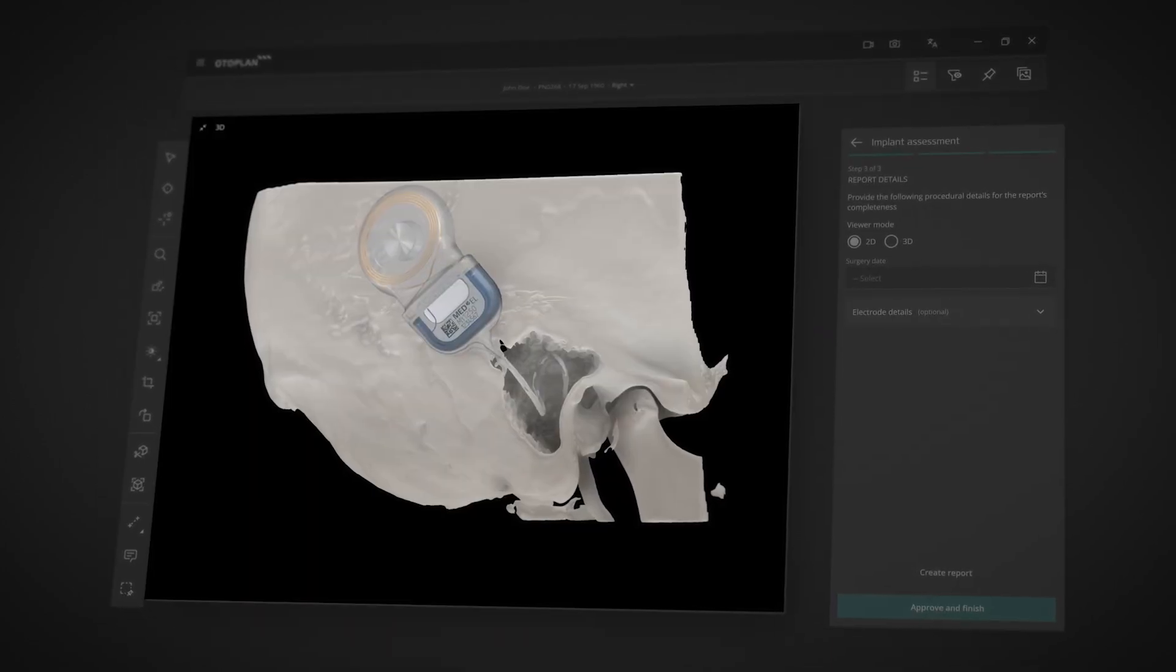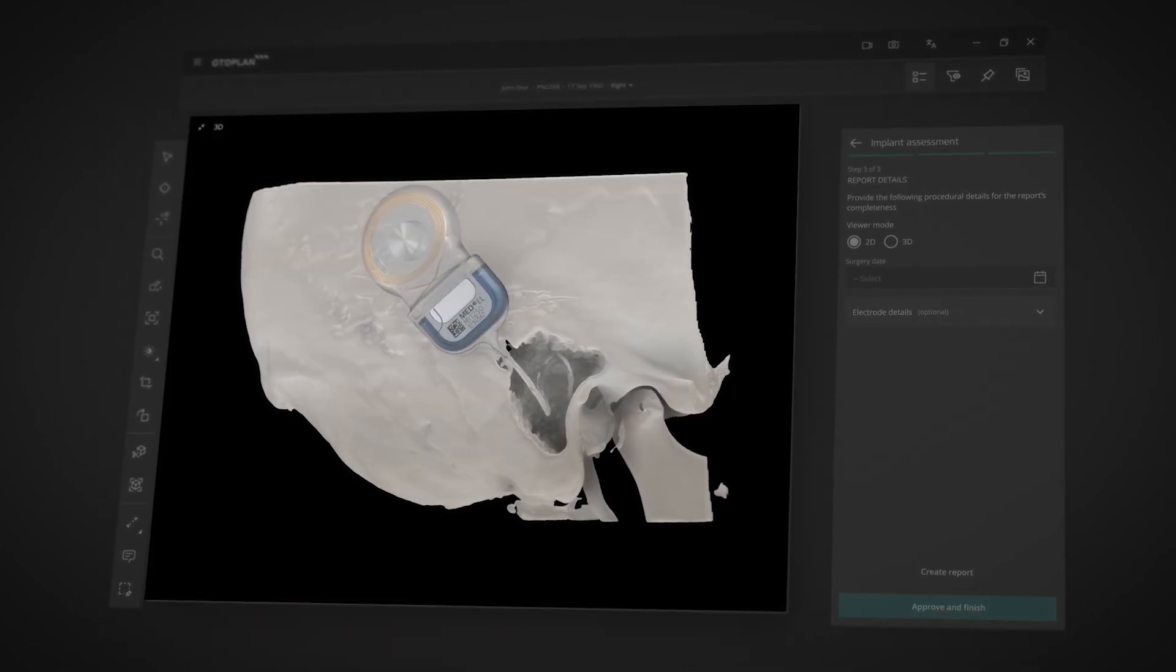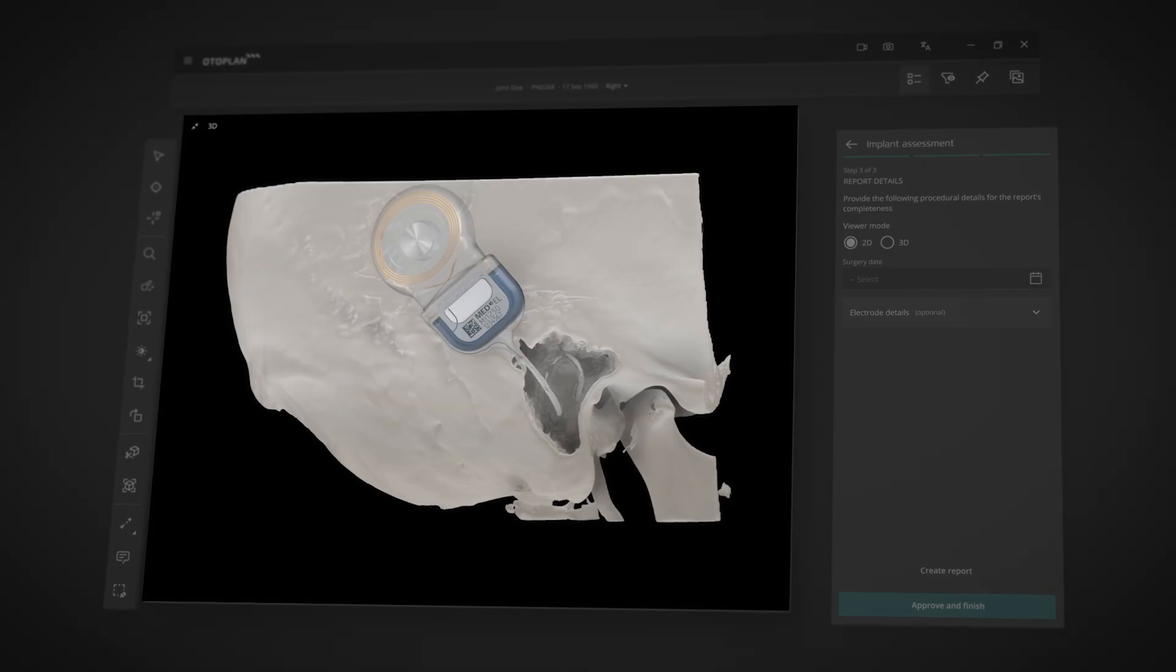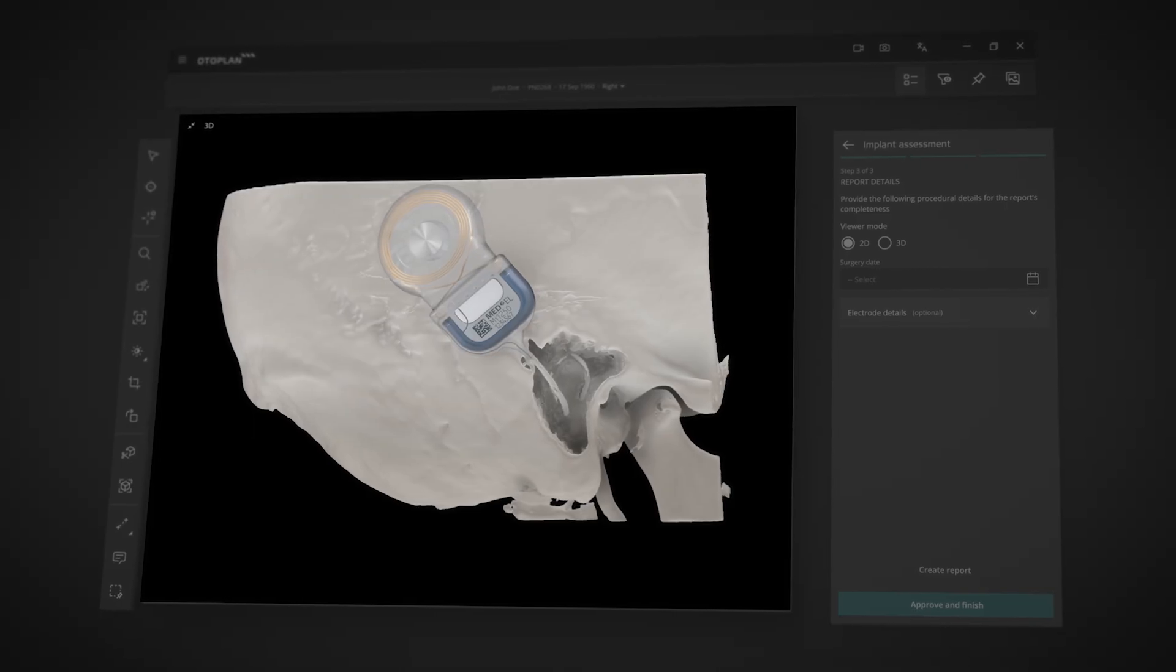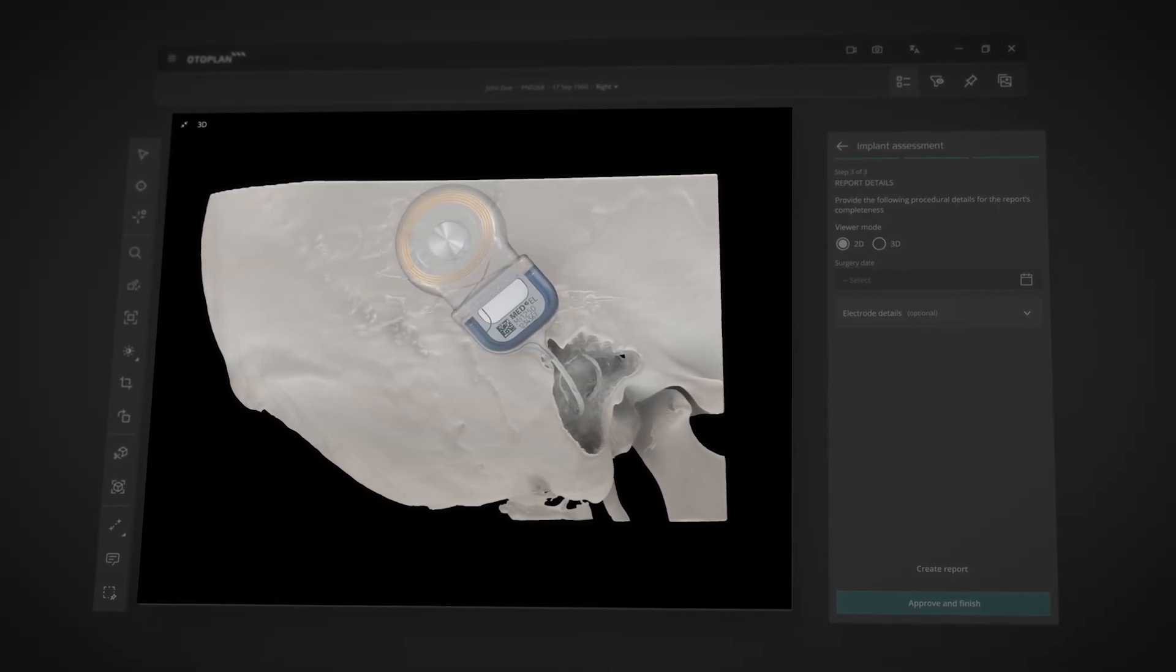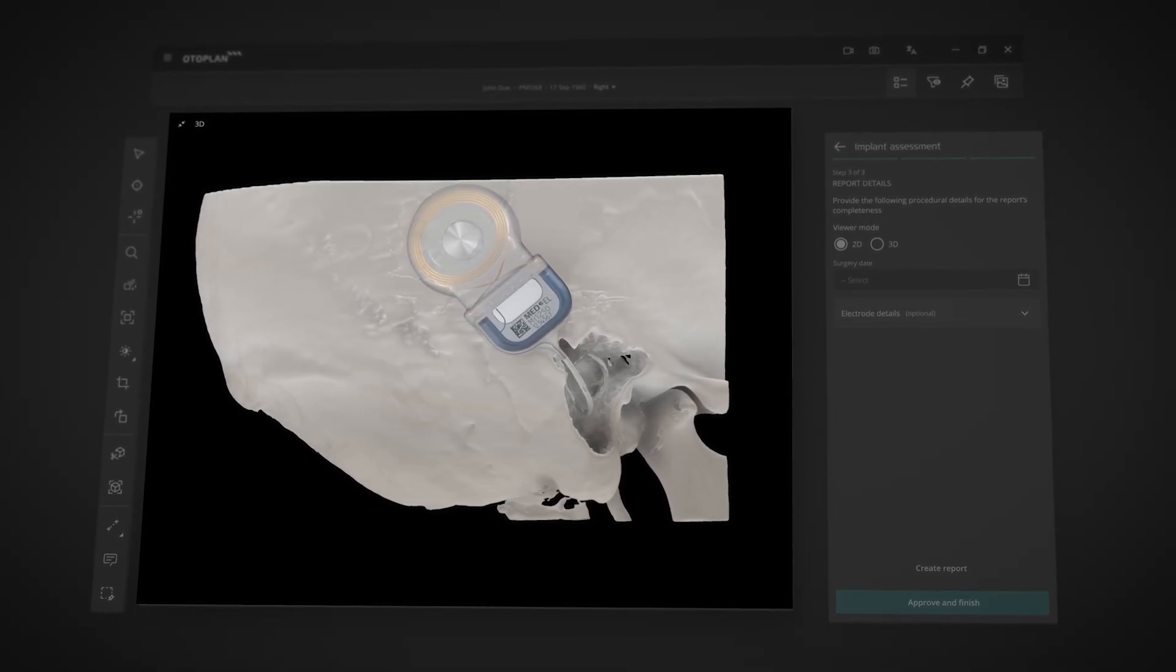OtoPlan now has expanded automatic detection beyond electrode contacts to also include the electrode lead and implant housing.